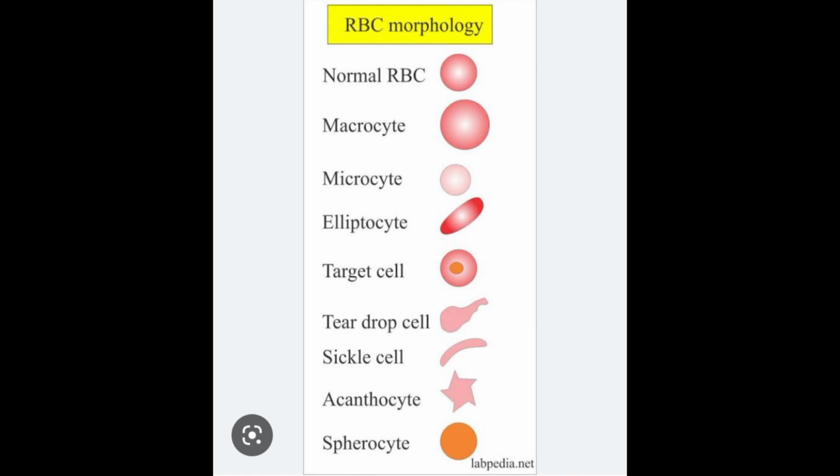The spherocyte. These are spherical RBCs without any central pallor area. These are usually slightly smaller in size. The spherocytes can be seen in hemolytic anemia and renal diseases. The presence of spherocytes is known as spherocytosis. Sickle cell. These are half moon shaped cells which often have a pointed end. The normal RBC tends to become sickle shaped due to abnormal hemoglobin. The disease is known as sickle cell anemia.